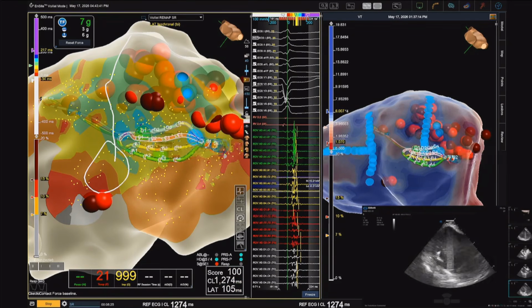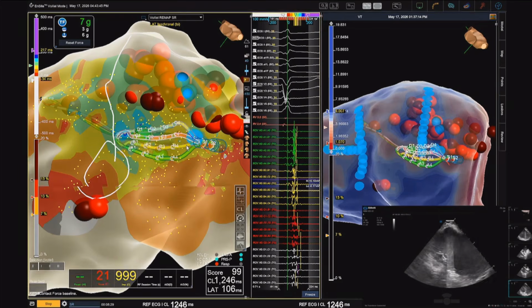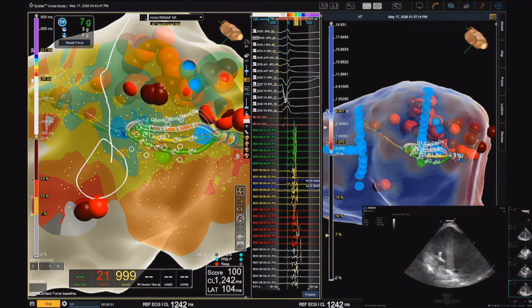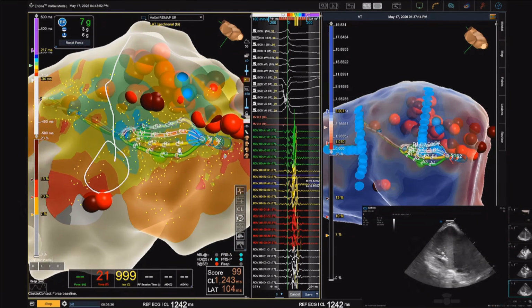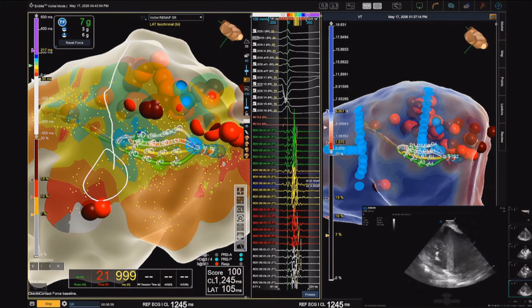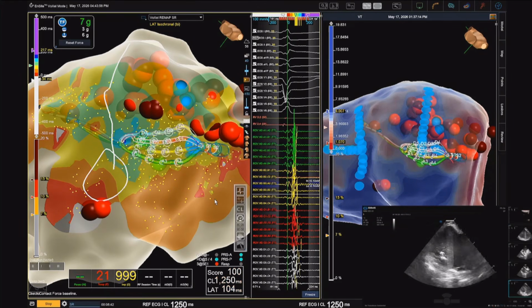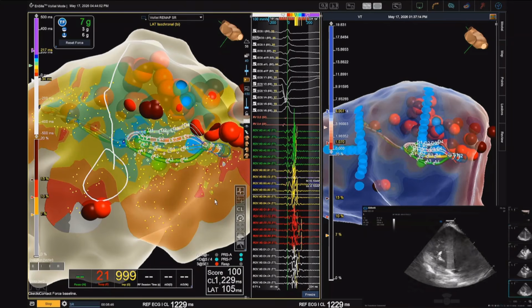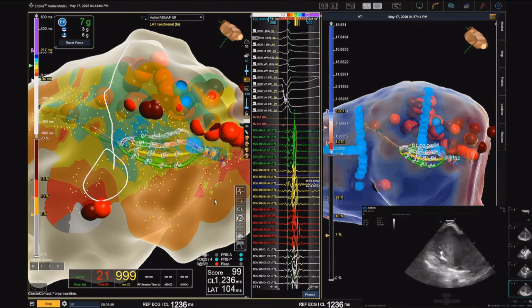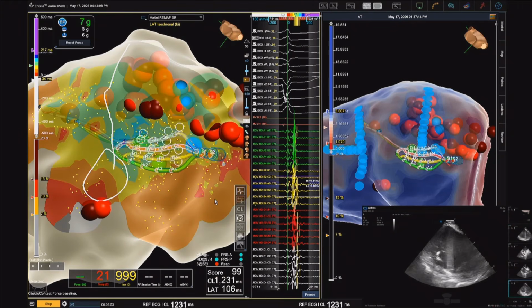You don't see that. You have the inside. Yeah. So all of these regions are the regions that we have to re-ablate. The rest is clean. You see the ablation dots that we have done in the most basal area, it's clean, but close to the papillary muscle, so anatomy again, there are still residual lesions. So we will re-ablate that region. We will re-ablate the apical exit of the more apical channel, and then we will remap and reinduce.